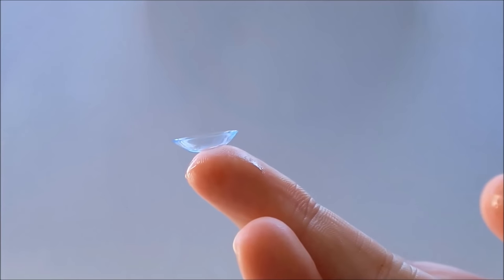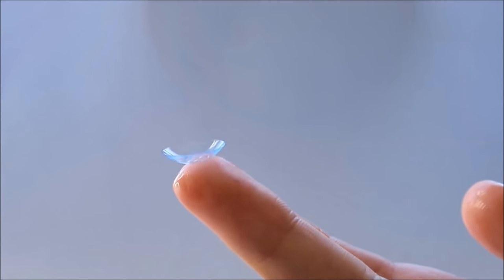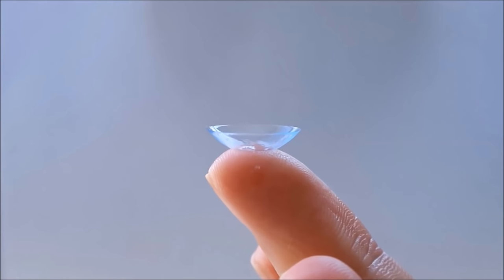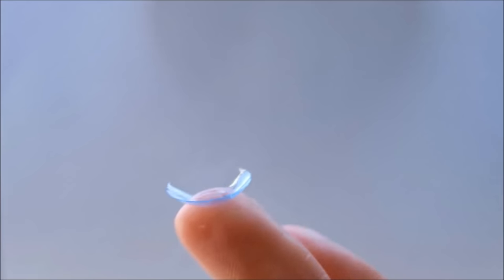This is what the right way looks like — it looks like a cup and it comes upwards to meet your eyeball. This is what it looks like when it's the wrong way out — it has a sort of flare at the edge and doesn't look so much like a cup. The difference is super subtle.